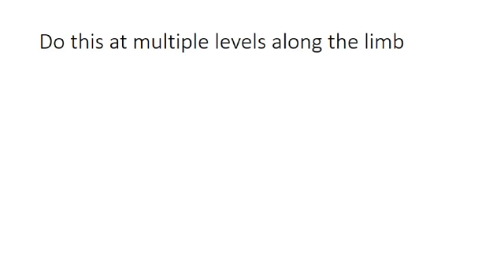If it's compressible, I even ignore the color Doppler there. But if it's not compressible in particular, then I put color and look for that. I may also look for phasic changes, and especially the calf augmentation at the mid and lower thigh. But mainly at the saphenofemoral junction and the popliteal, I do everything very scrupulously.